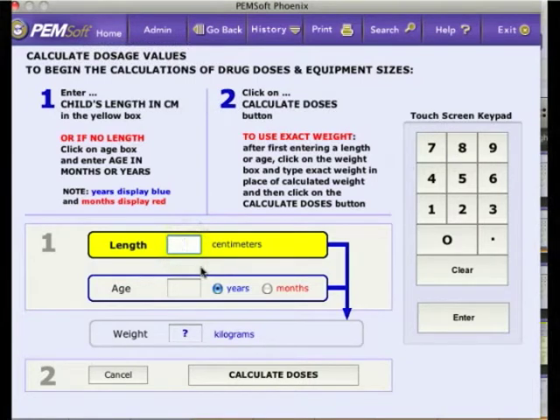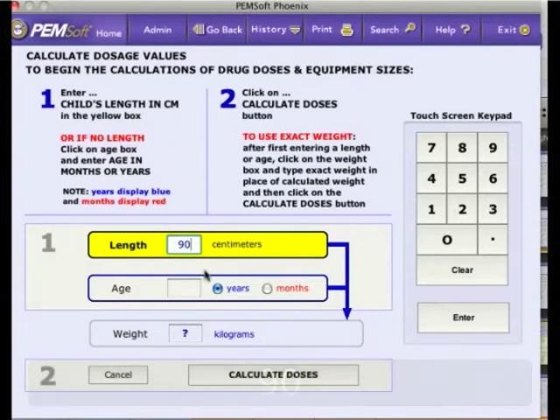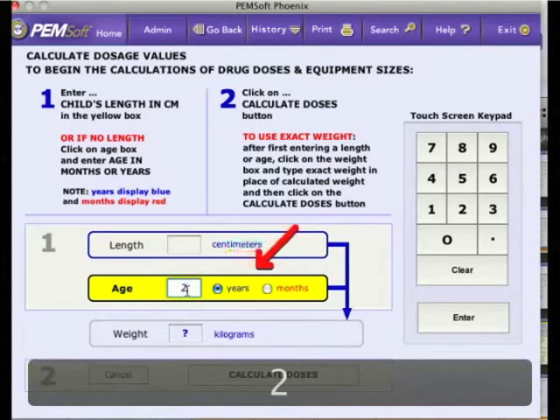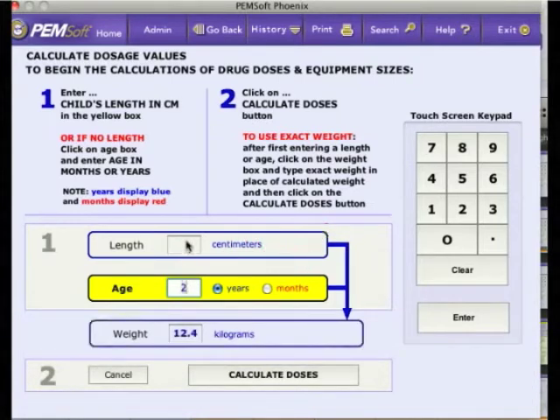Type in the patient's length using the computer keyboard or the screen's keypad. Patient length is the preferred size characteristic for drug dosing and equipment sizing. Alternatively, if you do not know the patient's length, use the patient's age. Be sure to select either the years or months button. Although age is not quite as accurate as length in determining doses and equipment sizes, it is close enough for most cases.